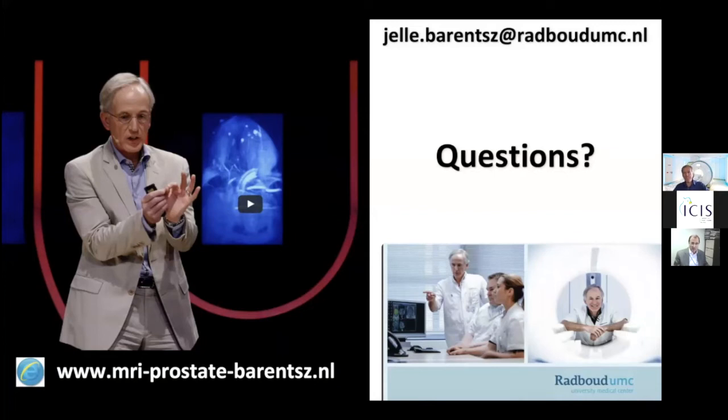Yes. So Ellie, if you give contrast and you see something, is it more likely or less likely that the lesion you see is going to be a higher grade, equivalent grade, or a lower grade than with just DWI and T2 by itself? That's a very good question, and it refers to the specificity and the differentiation between aggressive and non-aggressive cancer. If you ask the question between normal and cancer, it is more or less easy.